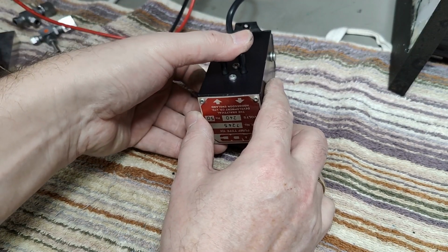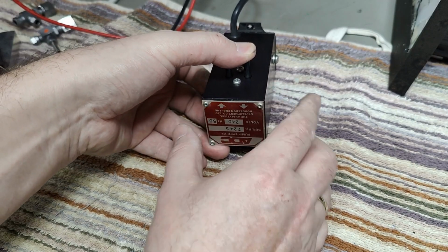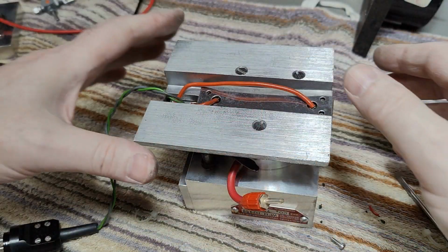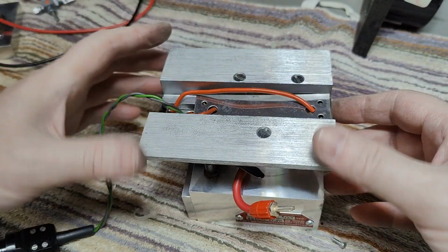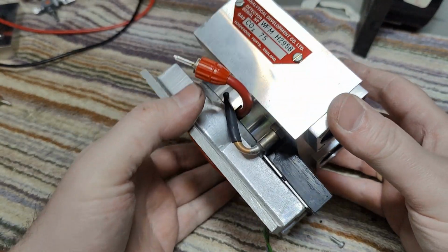So it's one of those vibration pumps. Pretty cool. But it really works. Got good gaskets. Maybe I can use those for something, maybe. You never know. To end this video with a deeper look inside this sensor.